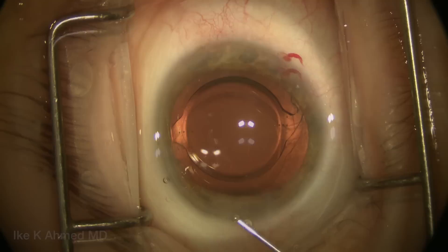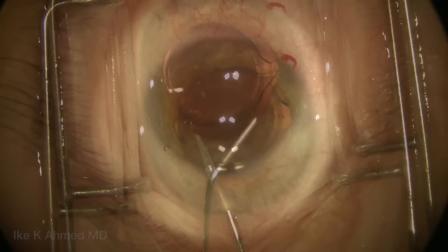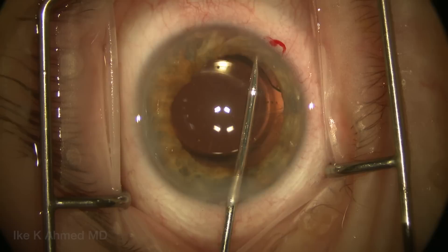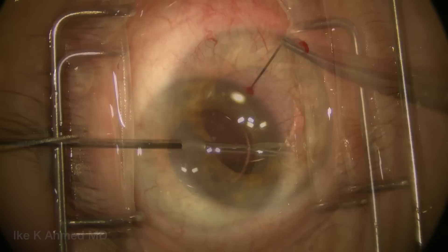Miochol is placed directly over the iris and swept centrally to try to achieve some pupillary constriction, which is minimal. We then use a pair of micro graspers to grab the pupil edge to bring it forward — notice how much tissue there is and the distensibility of the tissue. Even with a long-term chronically dilated pupil, we can actually get a significant effect.